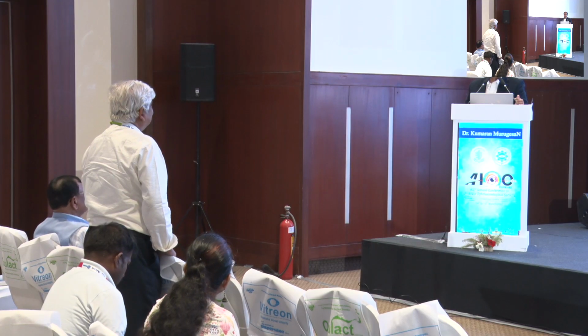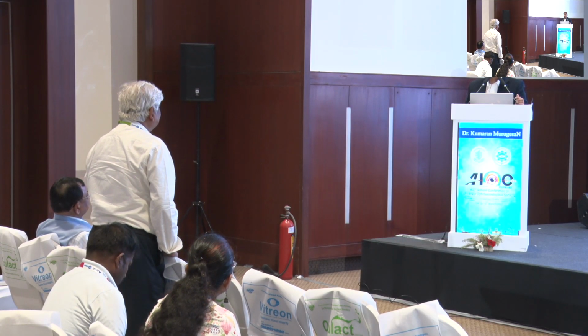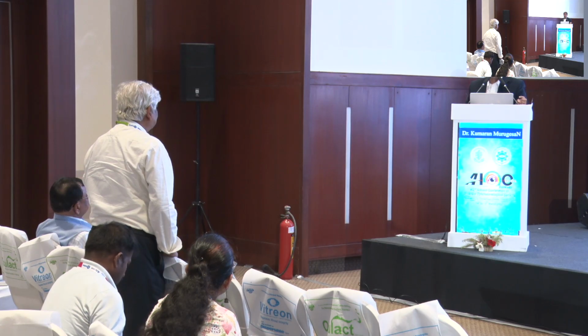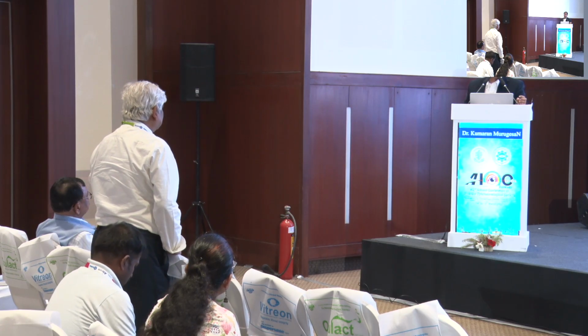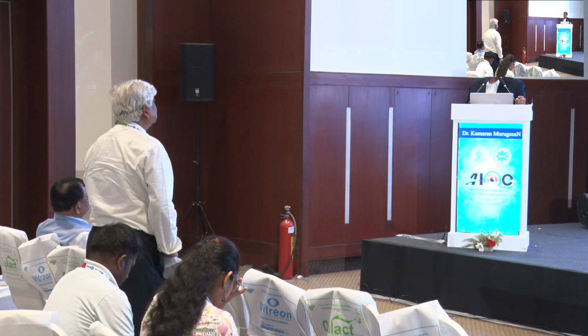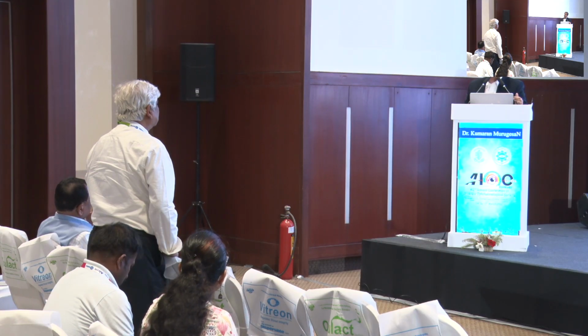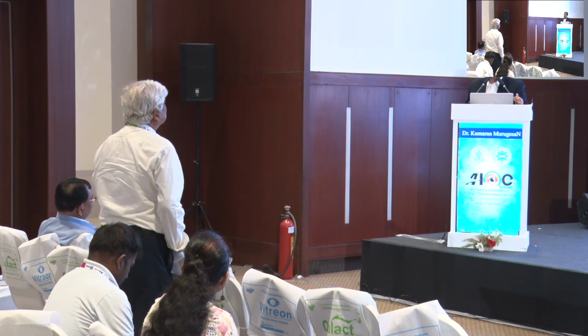See, the in thing now is the HVAC system, that is heating, ventilation, and air conditioning system. So we do surface disinfection with an aldehyde-free disinfectant, and then we would run the HVAC system 1 hour prior to the operation, which takes care of it.